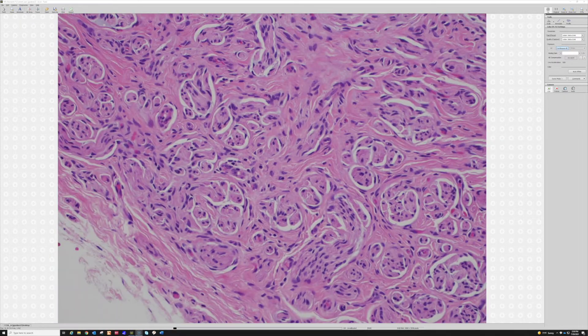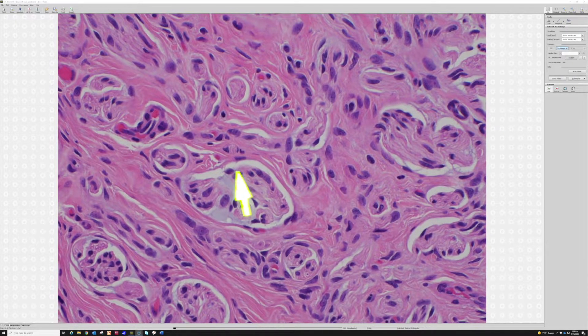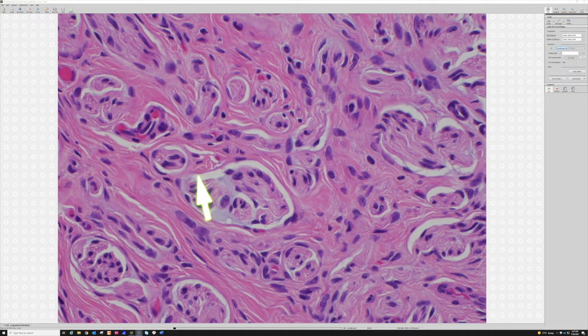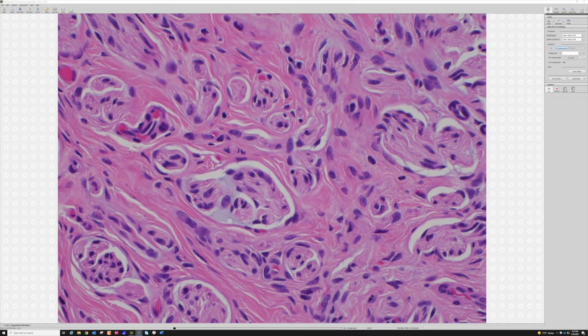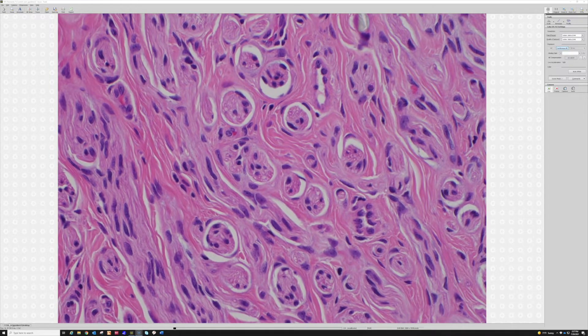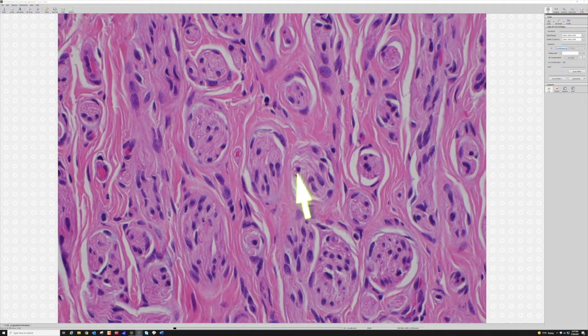In longitudinal section you can see how they kind of run like a nerve — gently undulating. Nerves, especially the little ones, will often get that cleft-like space that separates the nerve away from the perineural layer around it, and oftentimes there's a little bit of blue myxoid or mucin substance. Dermatology-trained people call it mucin; soft tissue and surgical pathology folks call it myxoid — hyaluronic acid, glycosaminoglycans, whatever name you like. It's the little blue goo, and you often find it floating around nerves and in the middle of nerves.